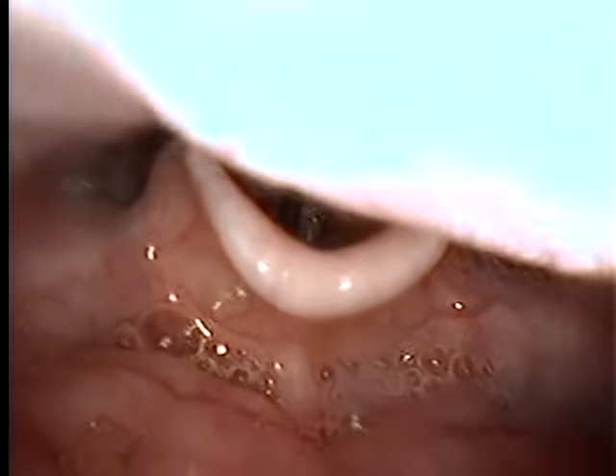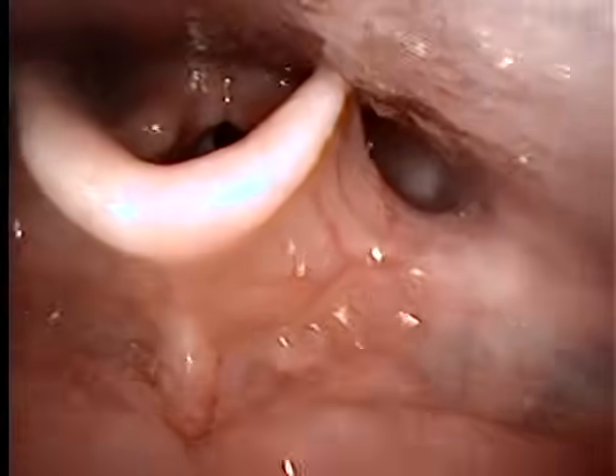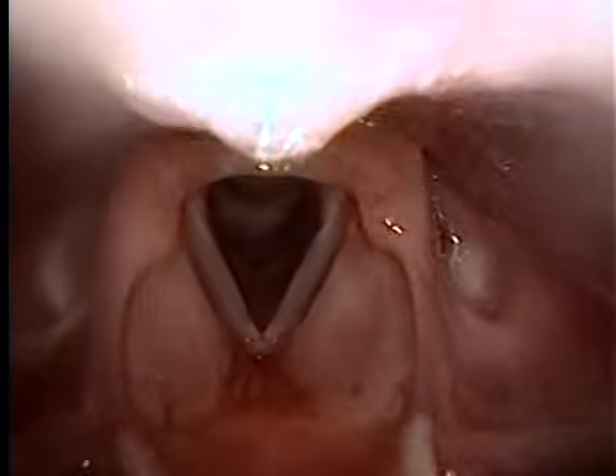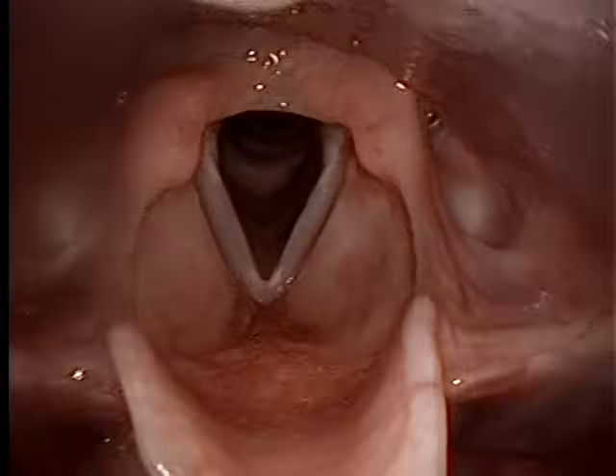Ah, ah, ah. Oh, you can kind of see it that time. And if you want, I can move so that you can keep seeing it. It may be interesting to see how the tongue is affecting and changing as you go. With the stroboscopy, you can see the sound of the tongue. Okay, good.